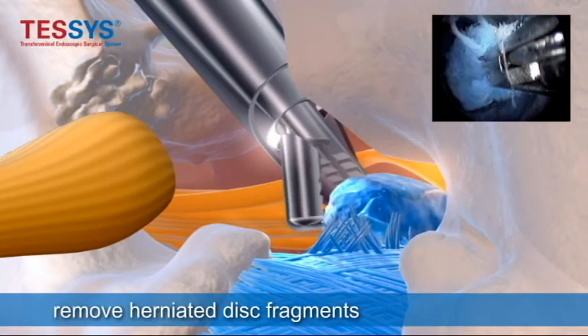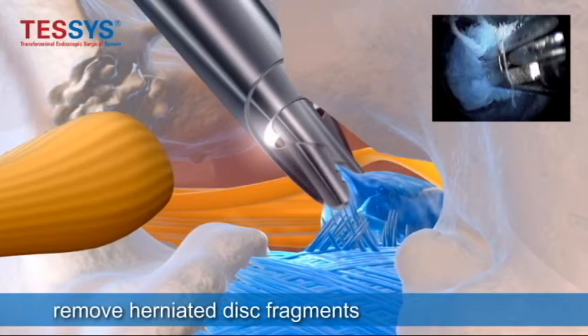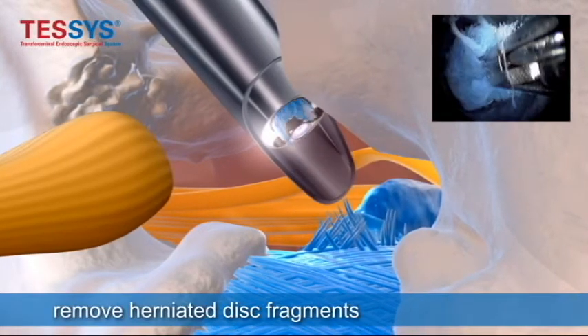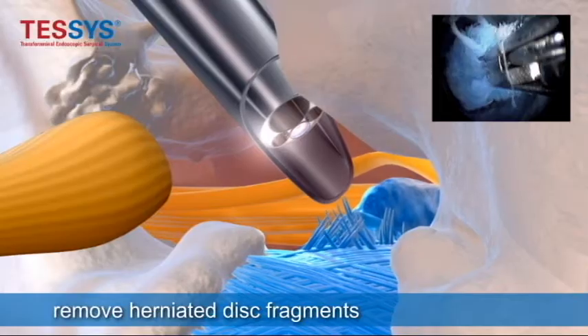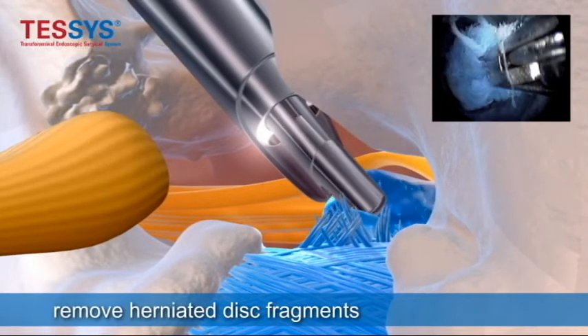As you pull it out, you can see in the background the traversing nerve root decompressing. Once it's completely decompressed, you can tell by looking at it directly — direct visualization.